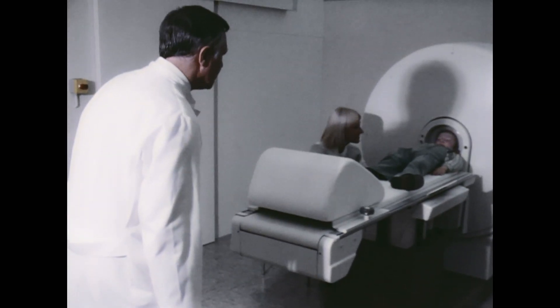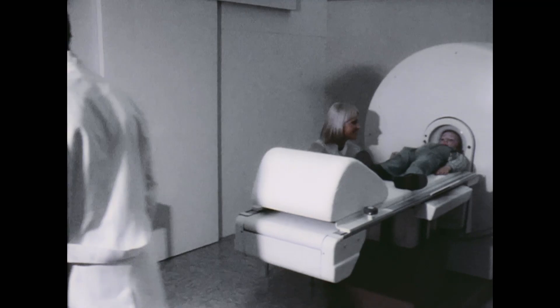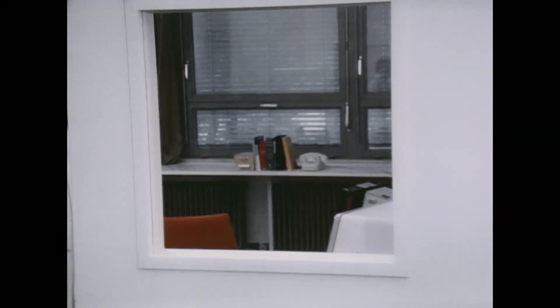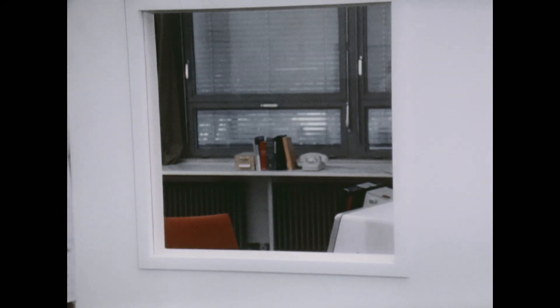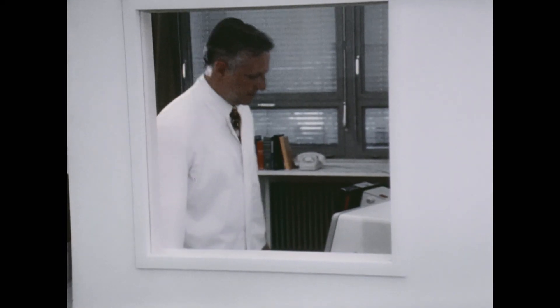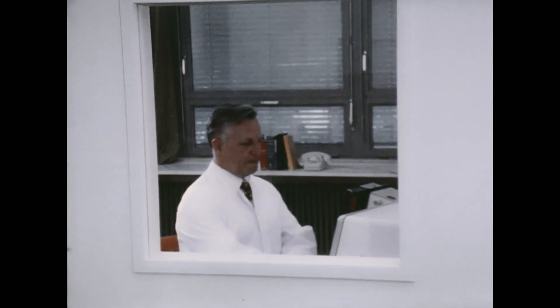Computer tomography enables a quantitative diagnosis of soft tissues to be carried out and represents an important supplementation of X-ray techniques used to date.